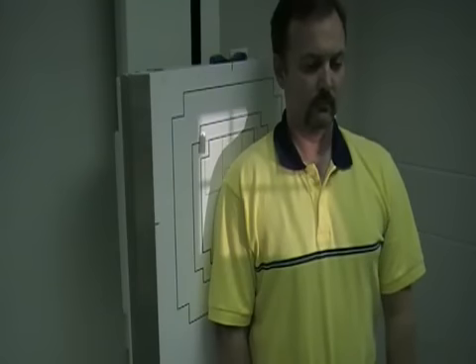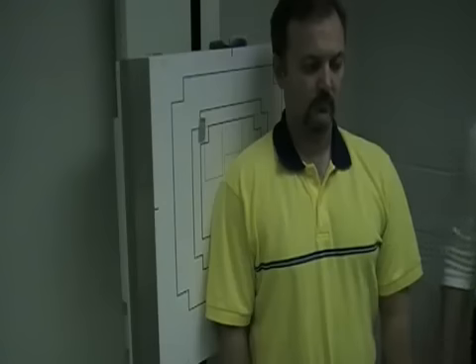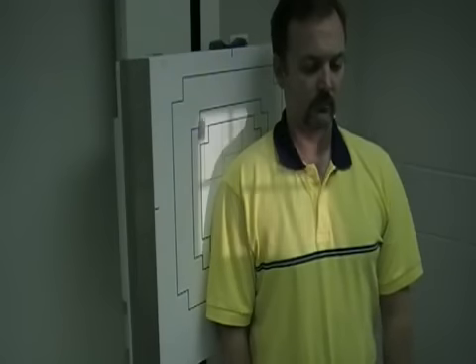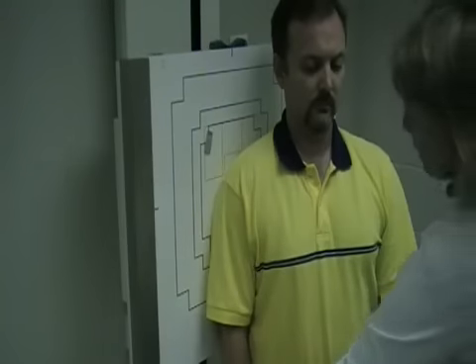Since I have moved my tube, I'm going to adjust the bucky tray accordingly. Okay, and make sure your right marker is showing, and I'm going to bring the arm out from the side. And this is our Grashey method for seeing the glenoid cavity.